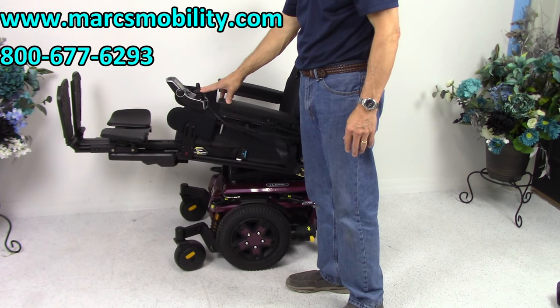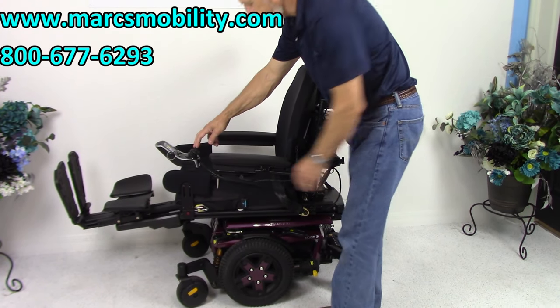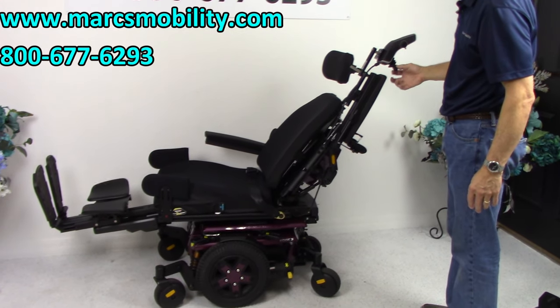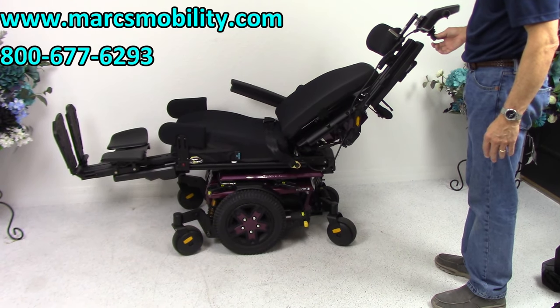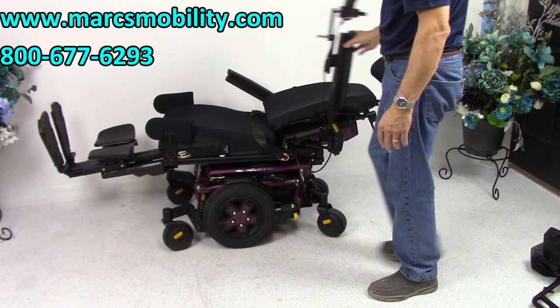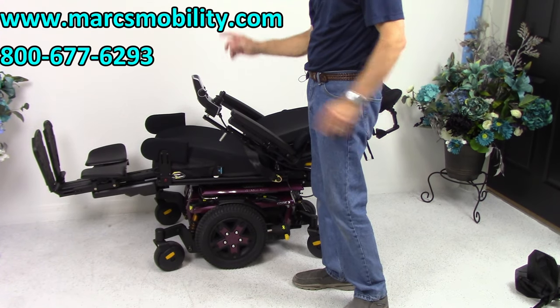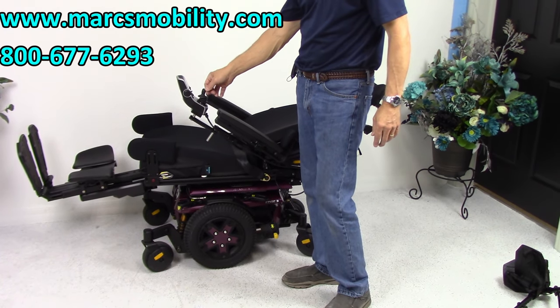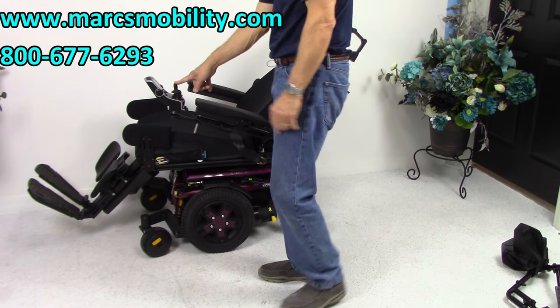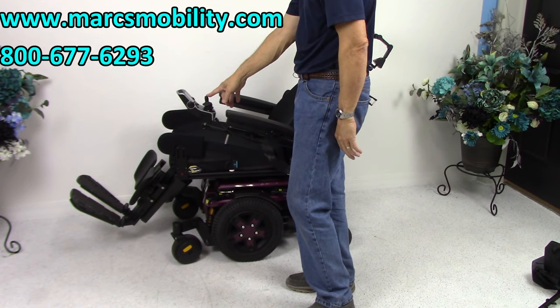I'm going to bring the seat back down. So far we've covered three functions. The last function is called the electric recline — that's when the back goes back on its own. We'll see how far it goes. This is your electric recline; if you were laying all the way down in your chair, this is what it would look like. Now I'm going to bring the back and the legs down together at the same time — you can do two functions at once. These legs are also adjustable, so whether you're five feet tall or six foot three, we can adjust the length of the foot plates. They'll still be electric, but we can adjust them with no problem.